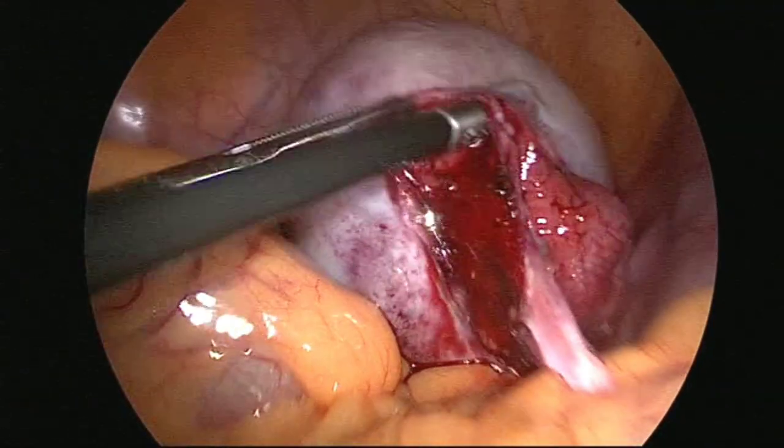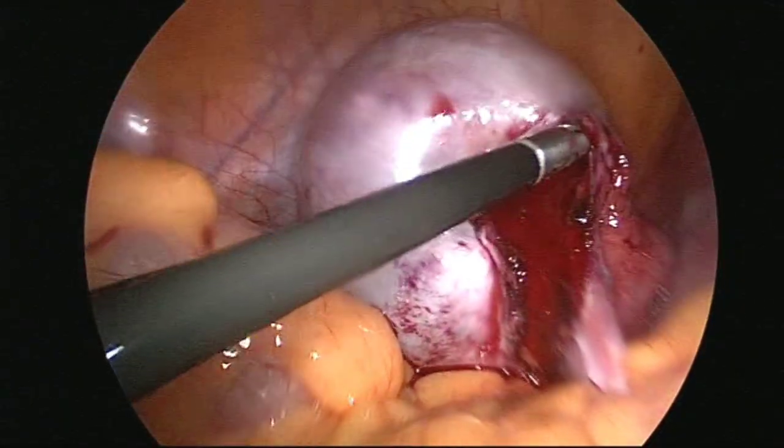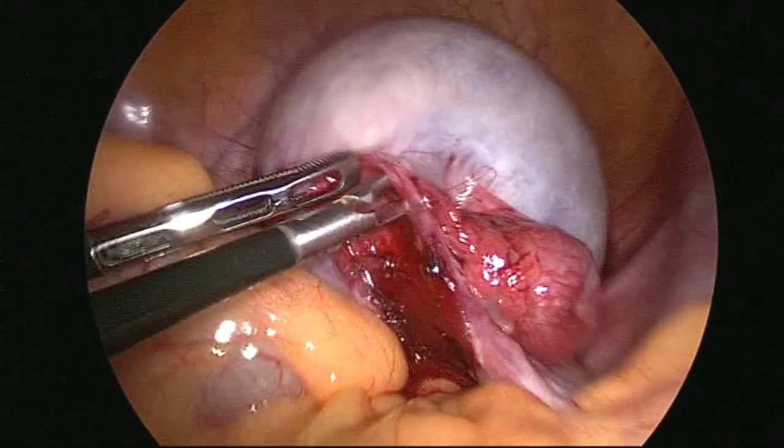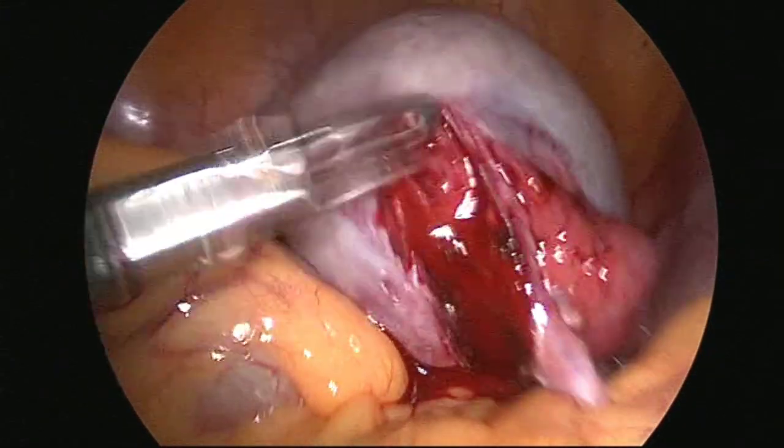Yes, this is the right plane. And once I reach the right plane, after that there will be no bleeding at all.